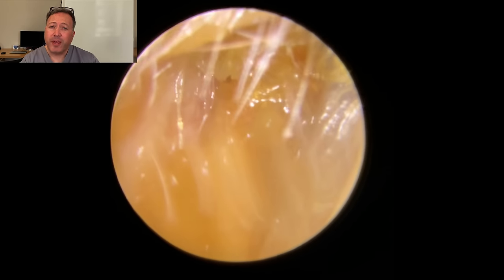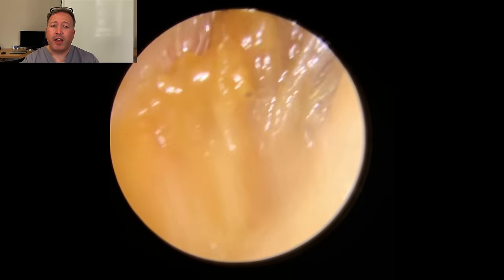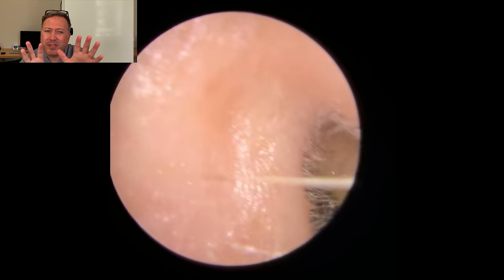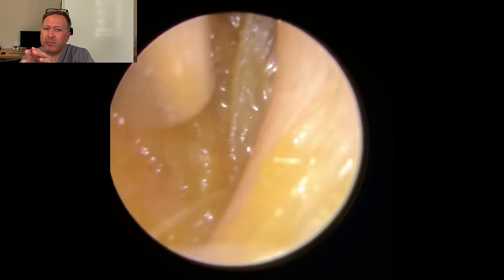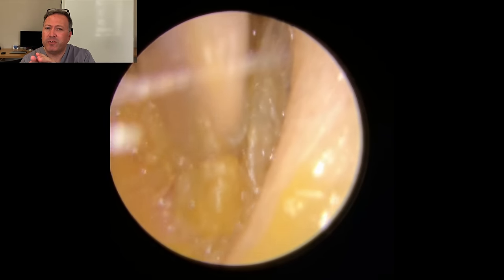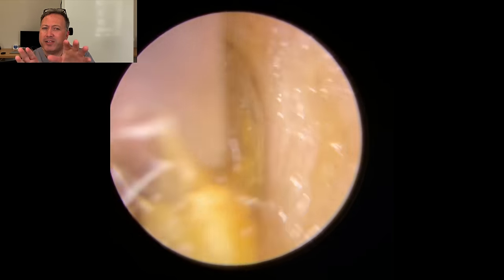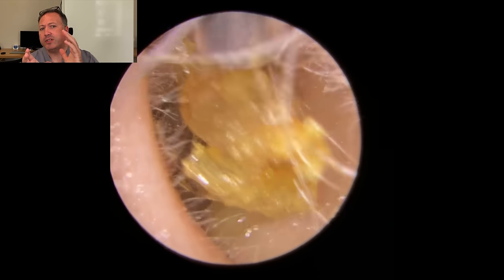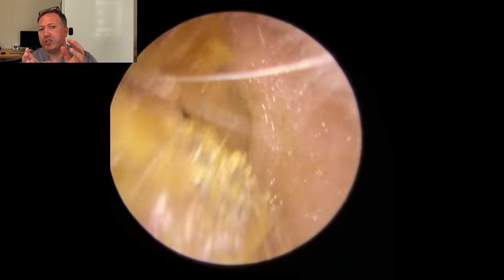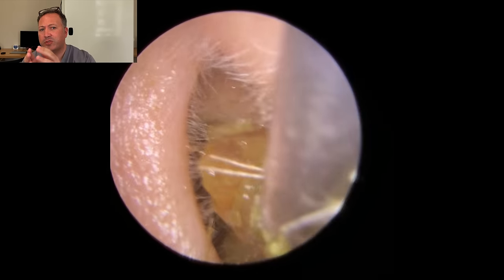So we're on our third patient now of this compilation. This ear canal, you can see, has some skin on the outside of it. So we've got a little bit of wet wax, a little bit of olive oil's gone in here. Patient softened up before they came in. That's the wax section there. But attached to the back of the wax, you've got this skin debris, which you'll just see there as we pull it across to the left-hand side.